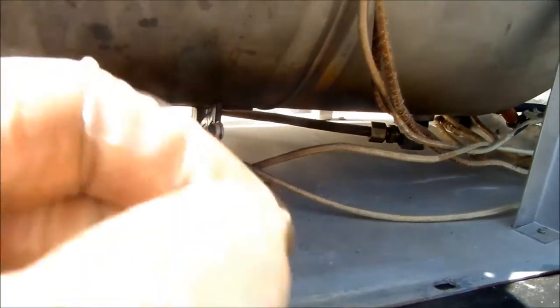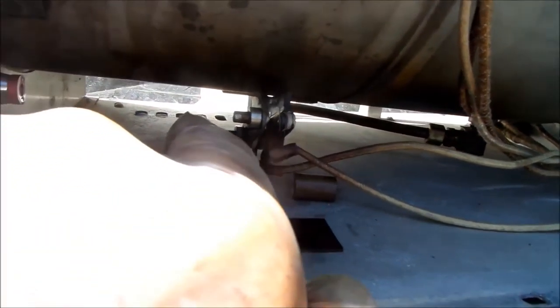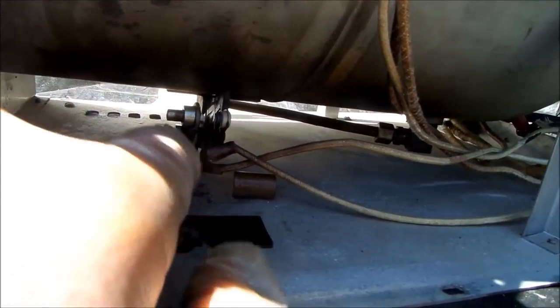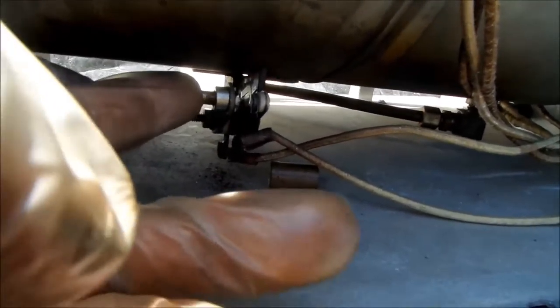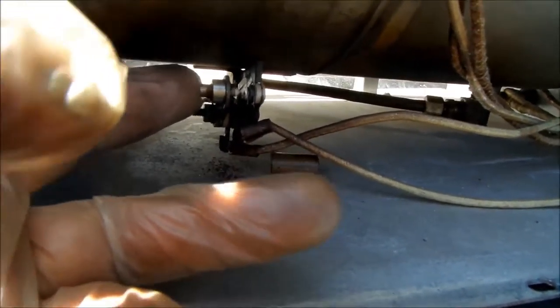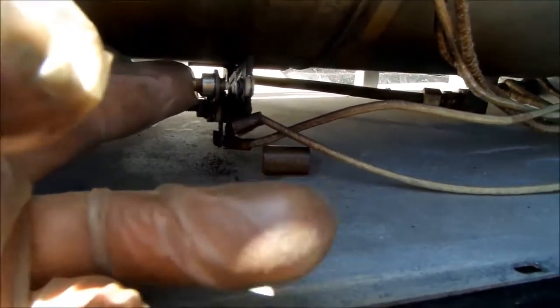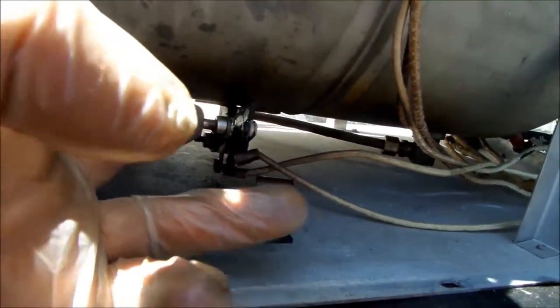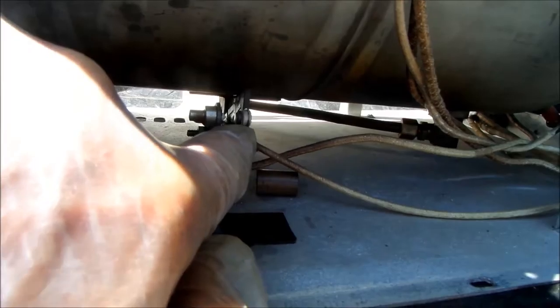That's the reset right there, and that's why this would not come on — simply because that part of the reset mechanism was frozen because of moisture in there. I put a couple of drops of oil on that, and that should be good. That was the only problem, and cleaning up those points should have it ready to go.